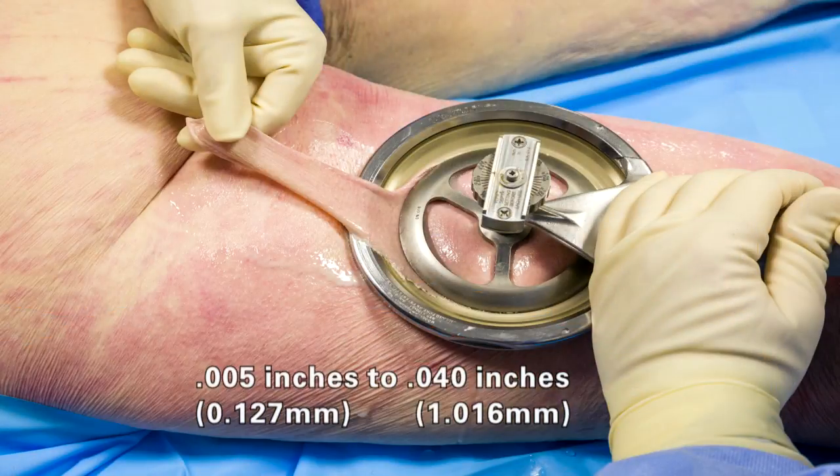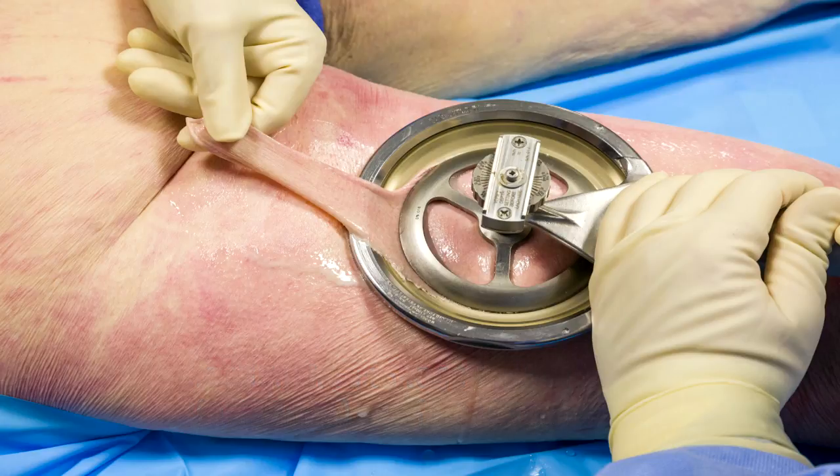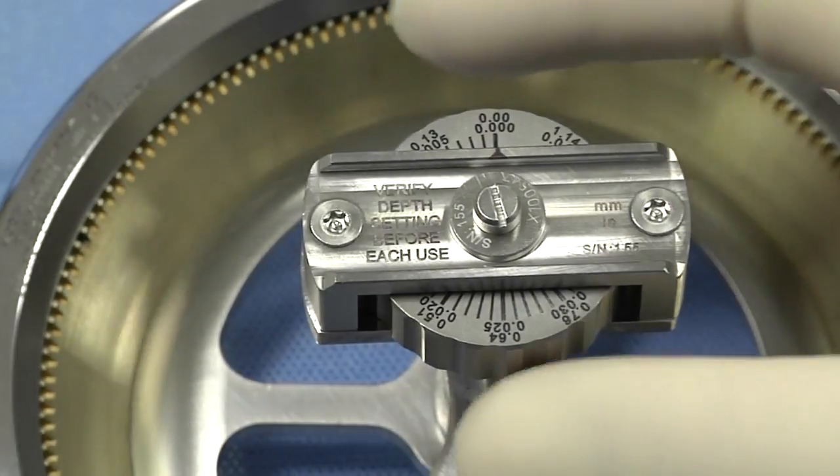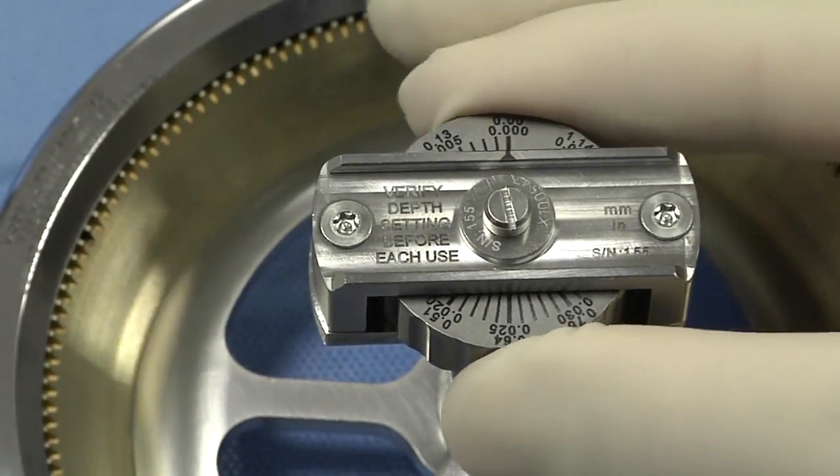Recovering skin grafts within the specified excision depth range ensures skin graft accuracy to the setting reflected on the depth adjustment knob. Adjust depth settings to the desired thickness by turning the depth adjustment knob.